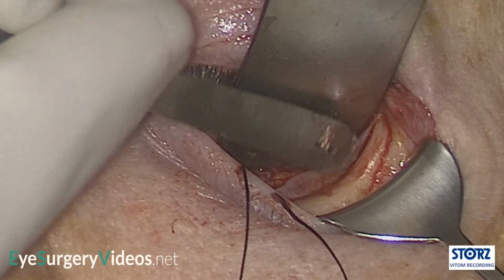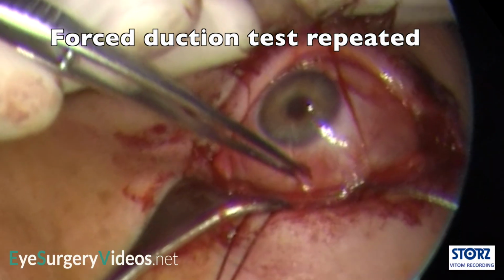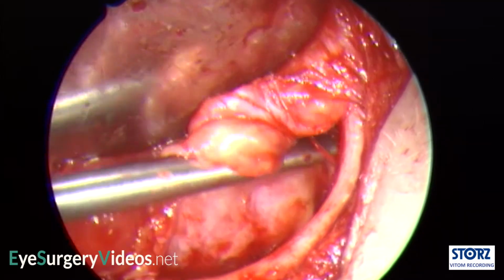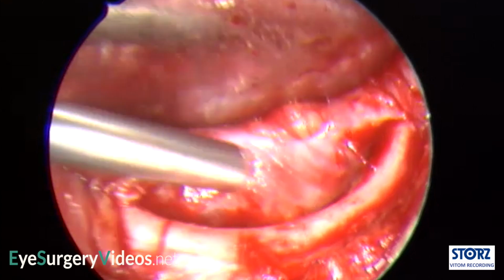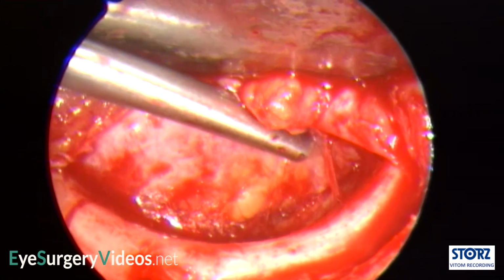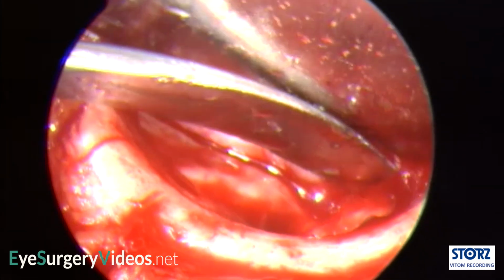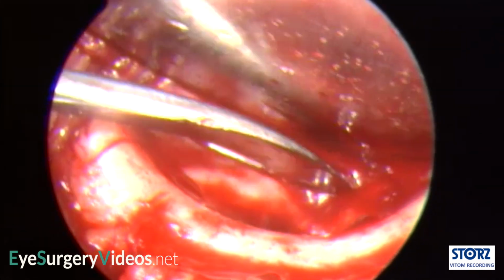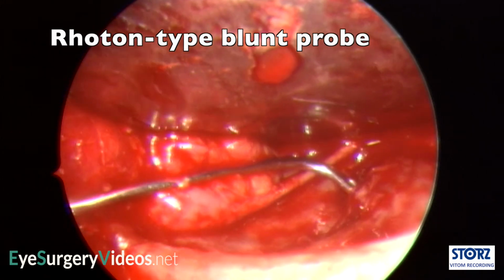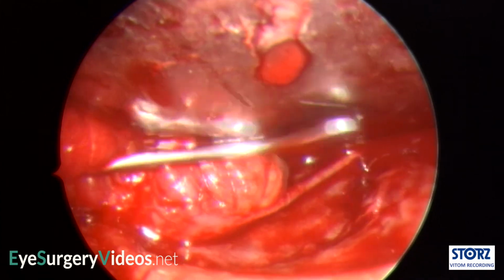However, the patient in this video is a young adult and the fracture occurred 2 weeks previously, allowing fibrosis and adhesions to develop. Therefore, the herniated tissue is more challenging to release and the bone requires more manipulation to facilitate it. The orbital floor is explored by passing malleable retractors hand over hand. The herniated tissue and the trapdoor fracture are located. The inferior orbital fissure can also be located.